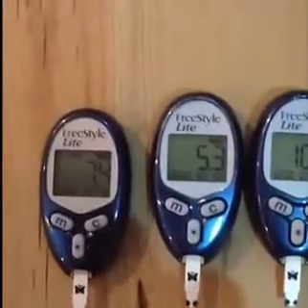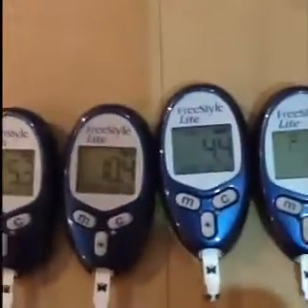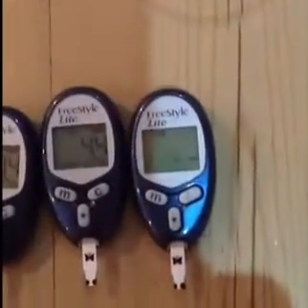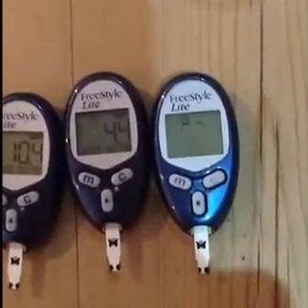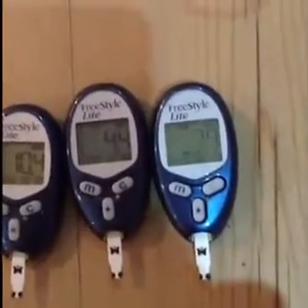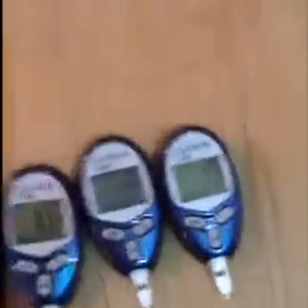Let's have a look at what they say. We've got 7.4 on that side — number one. 5.3 number two. 10.4 number three. 4.4 number four. And we're still waiting at number five. 7.9, which is very similar to the first one.